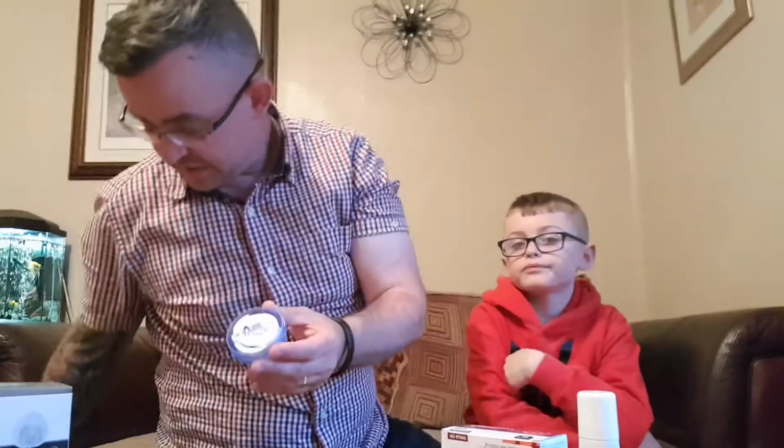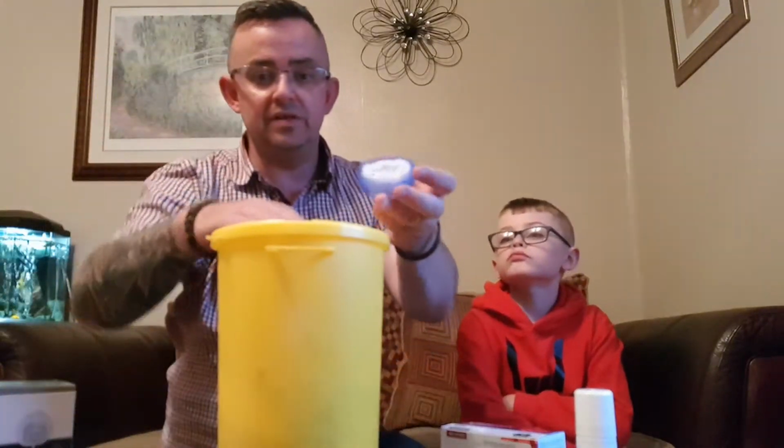So, we've attached the new site. Because of the needle, this goes straight into the sharps box. Keep it out of harm's way. So then we go back onto the screen. We're going to fill the cannula. So we tick that one, and press start. What that is doing now is filling the little tube that's been inserted just under the skin. So that doesn't take long.